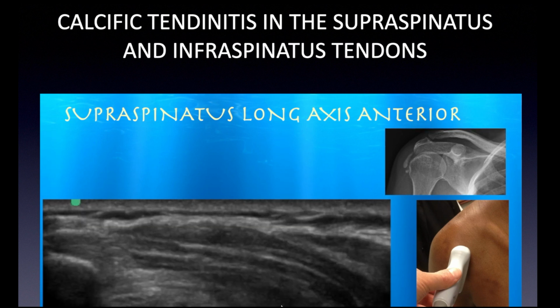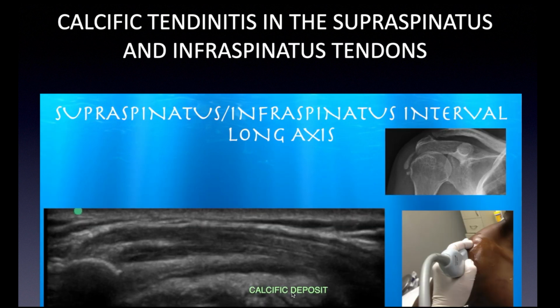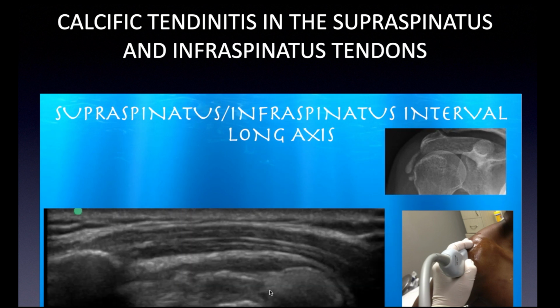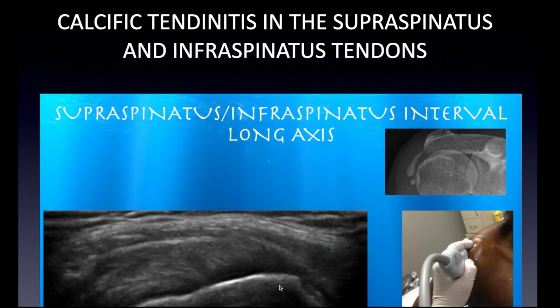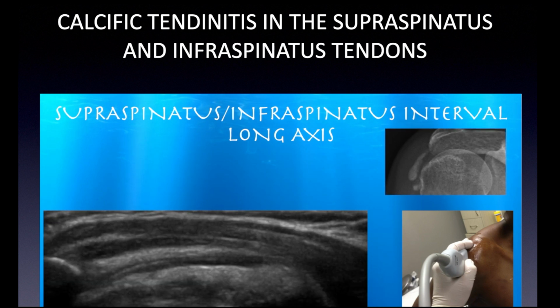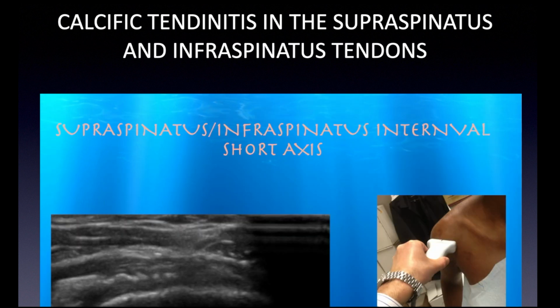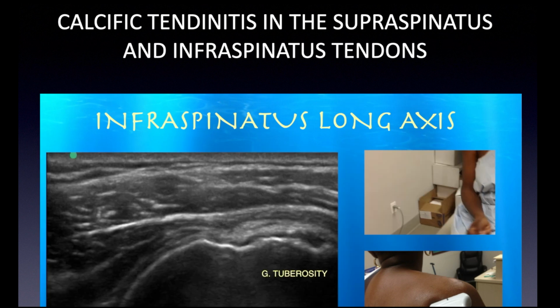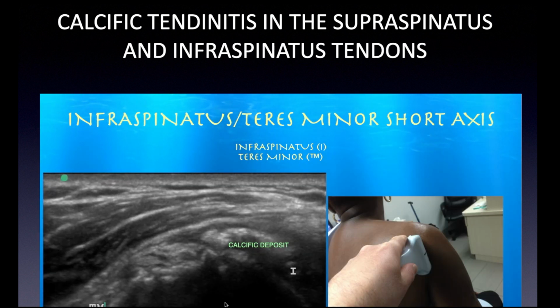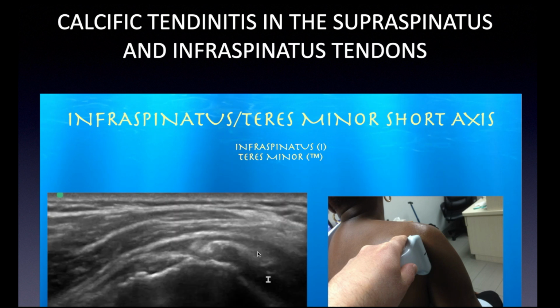All right, anyway, so back to her. So this is this whole globular calcific deposit, and to me it doesn't look like she has a hard rim or hard shell. This is more in that early to mid resorptive phase, so it's easy to actually get out. Even the back of her shoulder, this calcium deposit goes through.